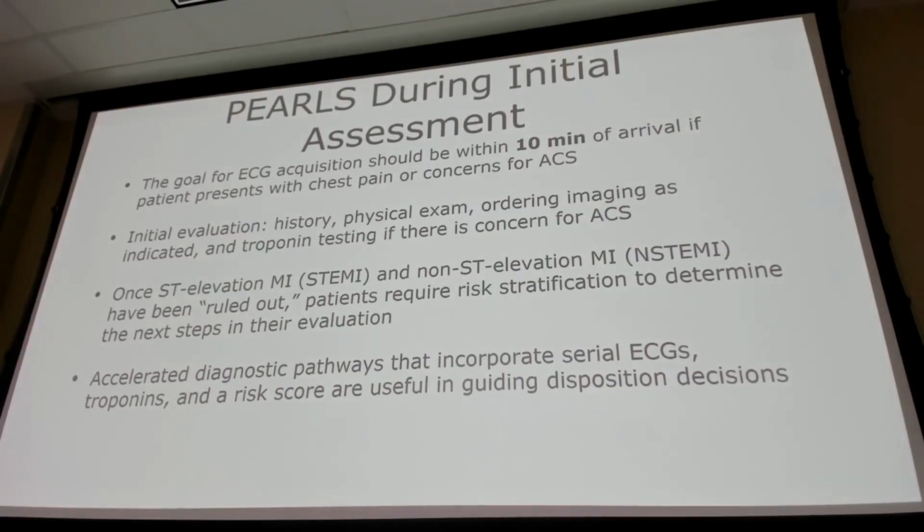All right, so there's our goal. We want to get that EKG within 10 minutes, and it needs to be interpreted by a provider, and that's usually pretty quick. If they show up at triage in the emergency department with chest pain, they get the EKG right then, and then somebody walks it back to a provider, and we take a look at it and decide whether we think it's STEMI versus NSTEMI versus normal.